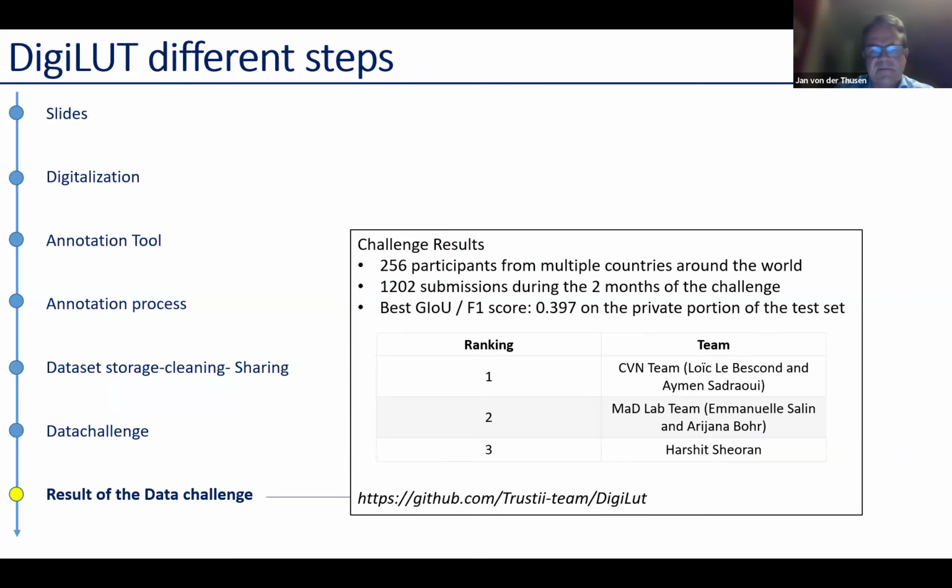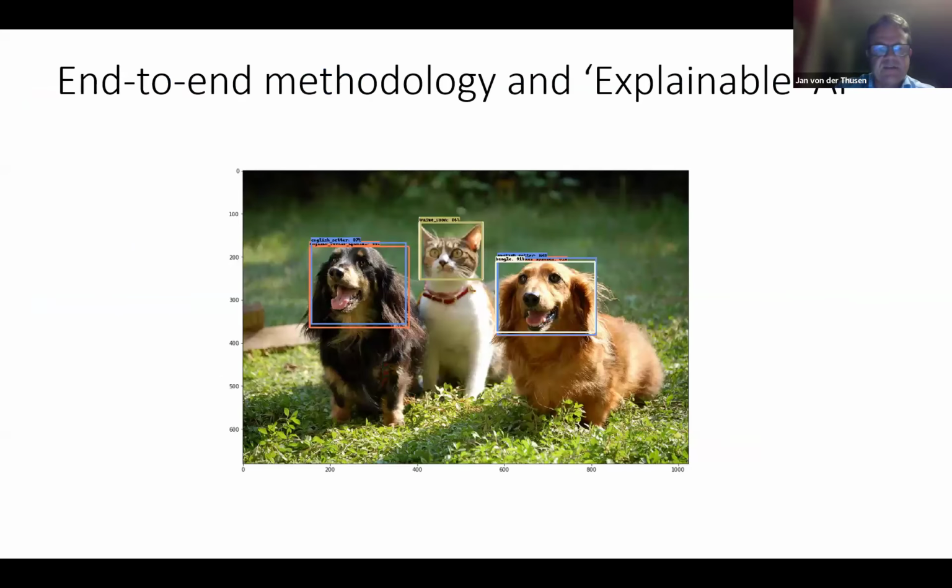Then three came up as the top-ranked teams, but looking at the F1 score, which is really a combination of the precision and the recall score in machine learning, and which ranges from 0 to 1, 1 being the best, we can see that it's at best moderate again. So I think that may also be, again, perhaps a result of the balance of the data that we used, as well as the correctness of the annotation.